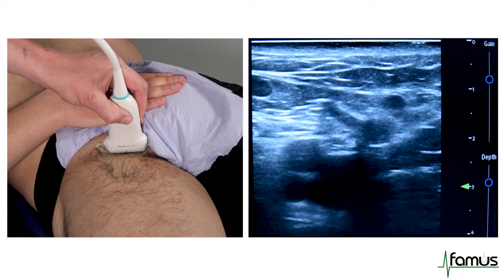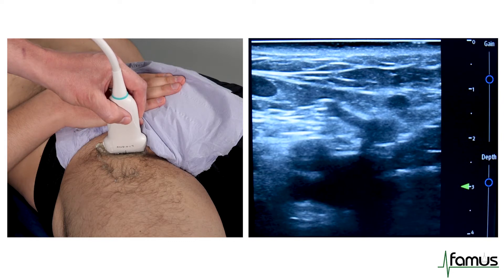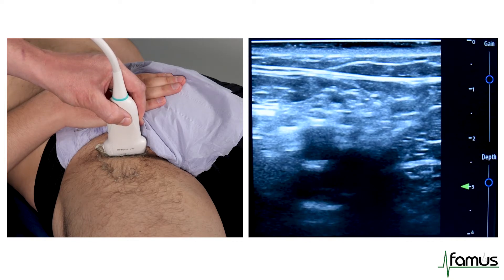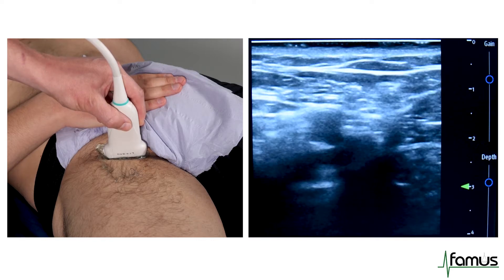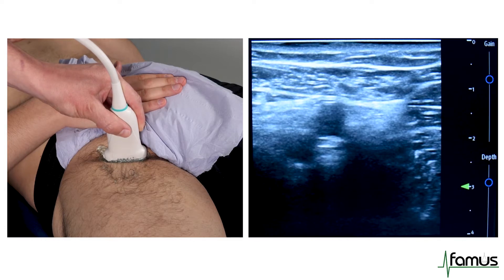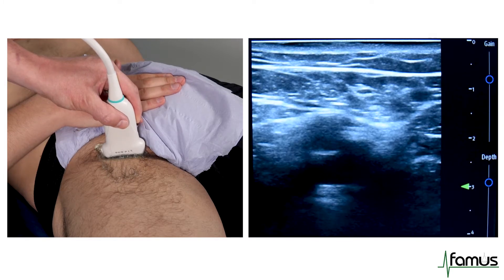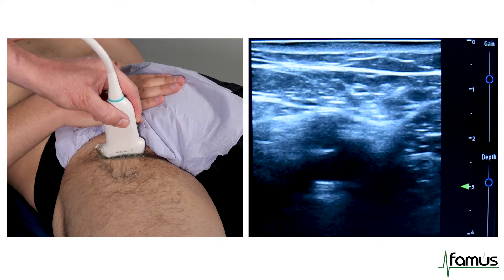Once you've identified the Mickey Mouse sign — and in this case we can see an early branch of the femoral artery — I move the probe a couple of half a centimetre distal and then gently apply pressure and look for complete compressibility of the femoral vein. Both walls of the femoral vein completely collapse and relax again on release of the pressure. This shows a patent femoral vein and therefore an absence of thrombus.